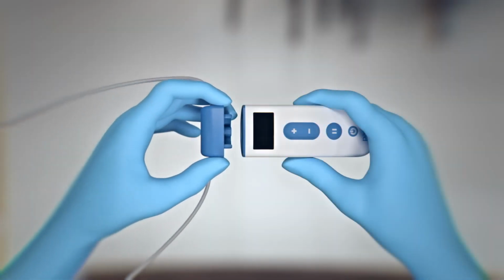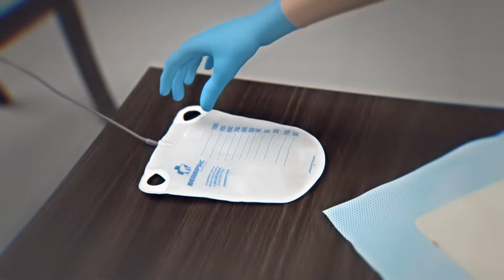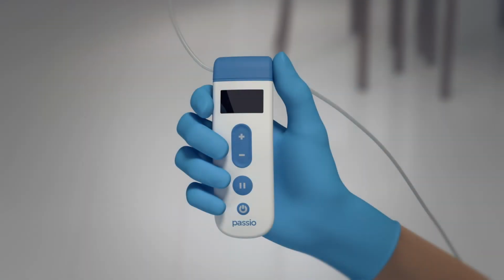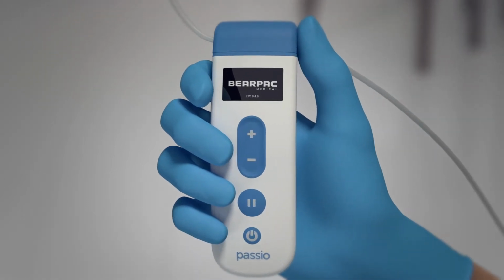Attach the pump head to the Passio handheld control unit. Now place the Passio handheld control unit and the collection bag at or below the level of the chest for draining. Press the power button on the Passio handheld control unit to activate the system. The system will cycle through the following screens. Note that the system must be primed before initial drainage therapy.